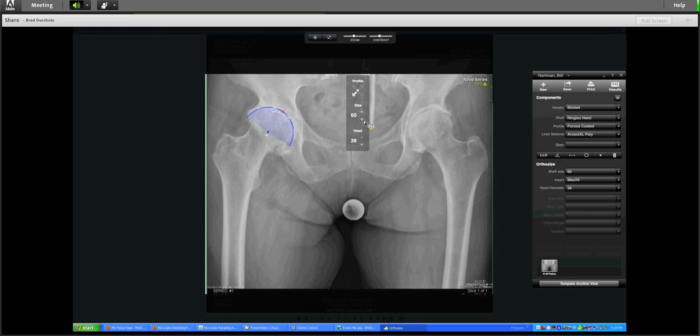Let's maybe make it just a hair smaller and see how it looks. Maybe a 58 looks good. I don't know, 56. Again, you're asking a knee guy to do this, so I'm going to say a 56 for this sake is pretty good.